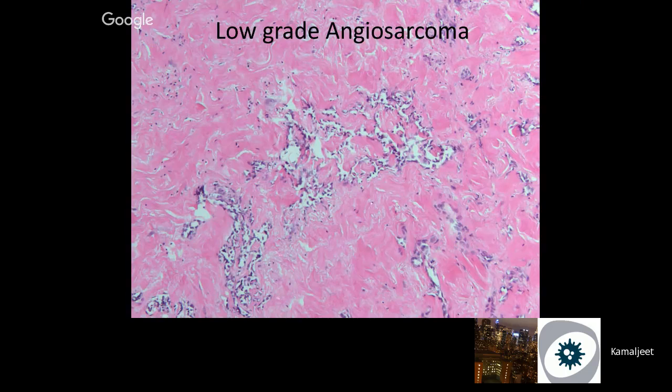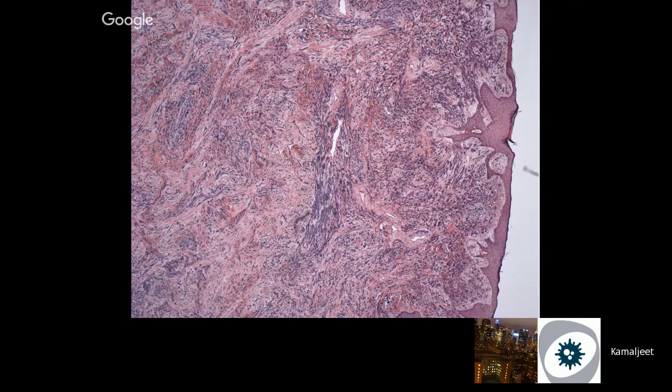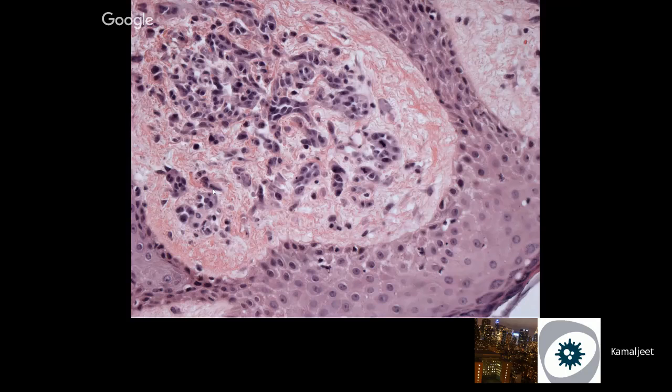More pictures: it is dissecting through the collagen and may look very bland. But what would help in both is the history. That patient had a history of lumpectomy with radiation, and now she presents with this vague fullness involving the skin after 3 to 4 years. This is another example of a high-grade angiosarcoma after radiation, and this is overt. It's involving the subareolar region. You can see the almost spindled proliferation, dissecting and involving the entire dermis.